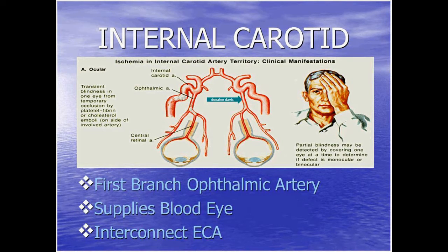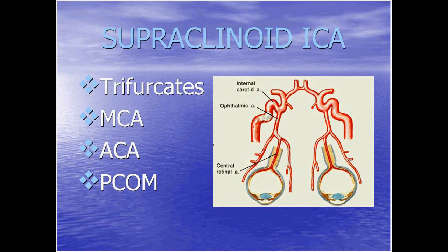But right now I want you to look at the internal comes up, loops behind the eyeball here. You see this little tiny distal right there? That little string is your posterior communicating artery, or your PCOM. I want you to look at how small that is. That thing is smaller than a piece of spaghetti, if you think about that. Very, very tiny. The communicating arteries, whether you're doing imaging or non-imaging, you cannot see them routinely. They are very passive. They even kind of sag down. If you look at some angiograms, in fact, I have some we'll show you, or MR angiographies, you'll see that these vessels just kind of hang out. They're not functional. They're dysfunctional until we're asked to do something with them.